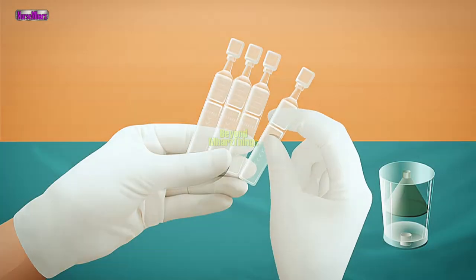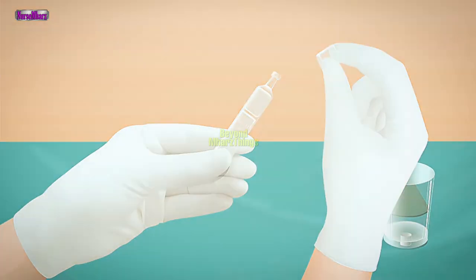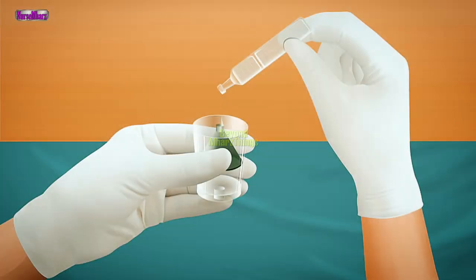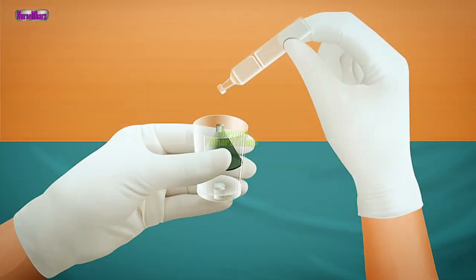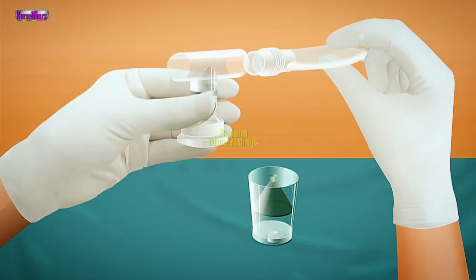Add the prescribed medication and diluent if needed to the medication chamber of the nebulizer. Check the required fill volume for the device used.